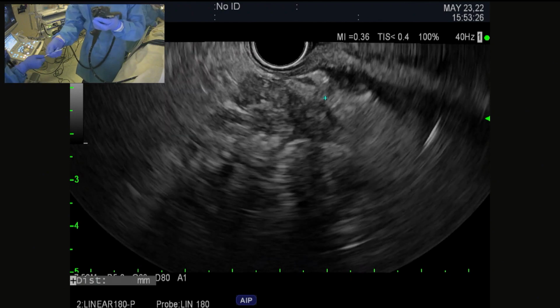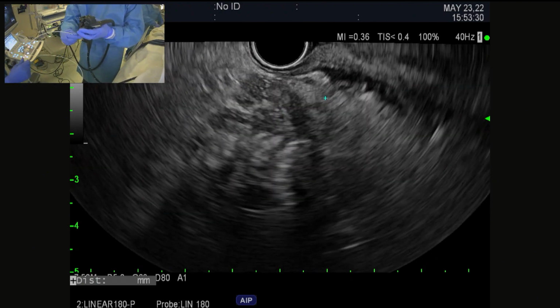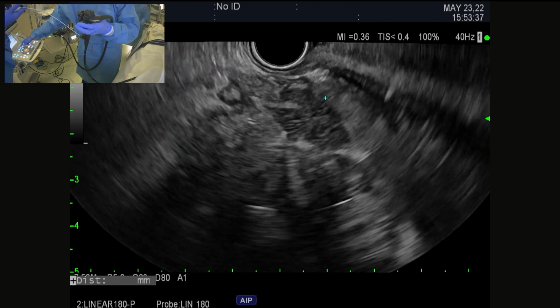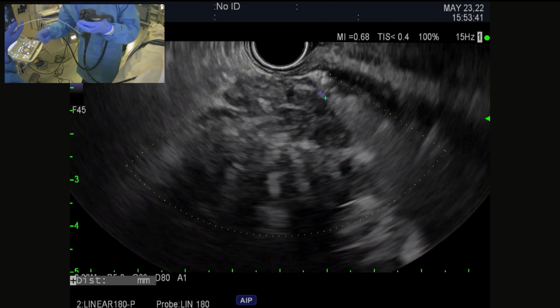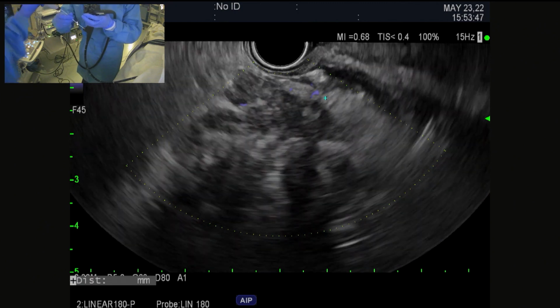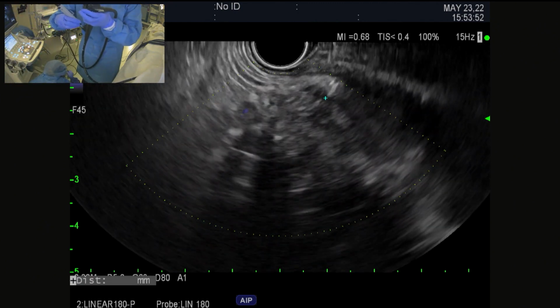Ken, by the way, it is a percutaneous. Can I ask a quick question? Sorry to interrupt. Are you worried about the landing spot that you have, not in terms of getting in, but having enough out in front of you so that it doesn't shorten back too much? Or you think that whole thing is, I see. Oh, that whole thing is big. Mostly just that one space, but it looks big enough. Yeah, it's deep. It is big enough. It's quite extensive.